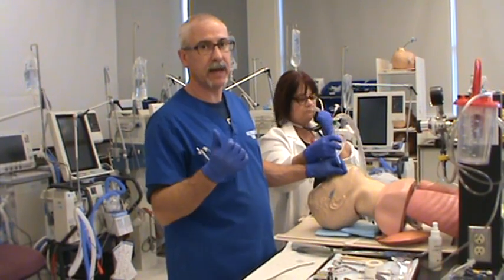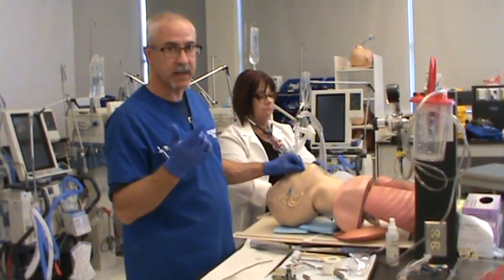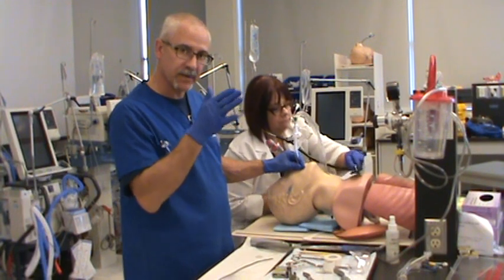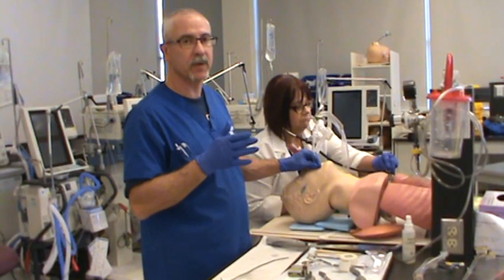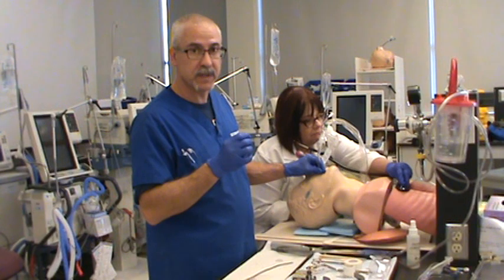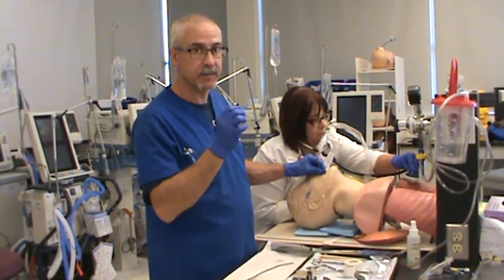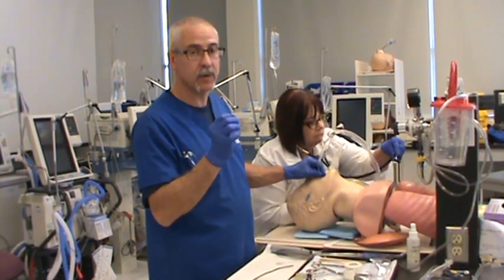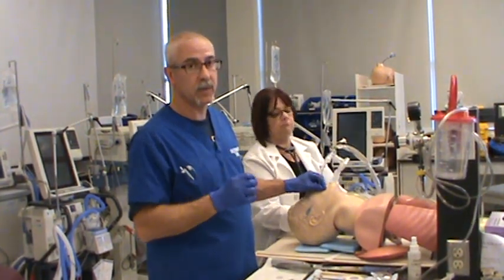Just to quickly recap: position yourself appropriately, place the laryngoscope blade on the right side of the patient's mouth, sweep the tongue out of the way while advancing the blade, and look for the patient's vallecula. The tip of the blade goes inside the vallecula, then with one upwards and forward motion you're lifting the tongue out of the way and exposing the glottic opening. Once you've visualized that, advance the tube to the required depth, making sure the tube goes beyond the vocal cords at least 2–3 cm, ensuring it's between the carina and the vocal cords.